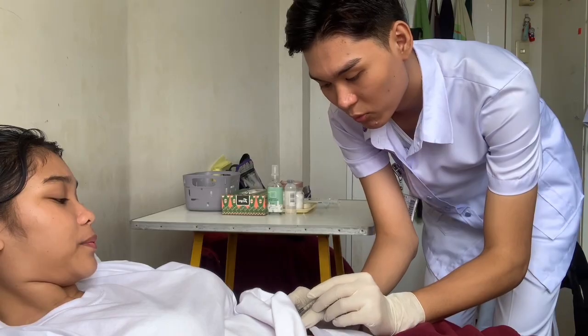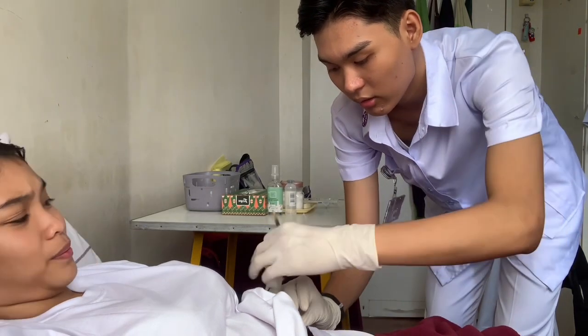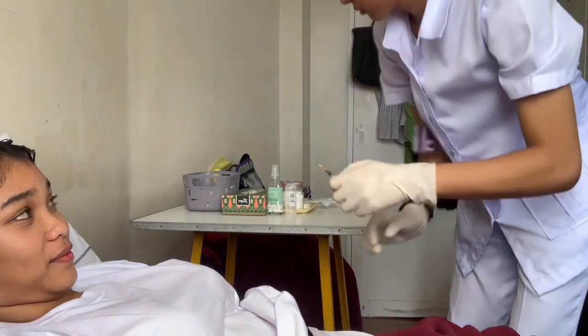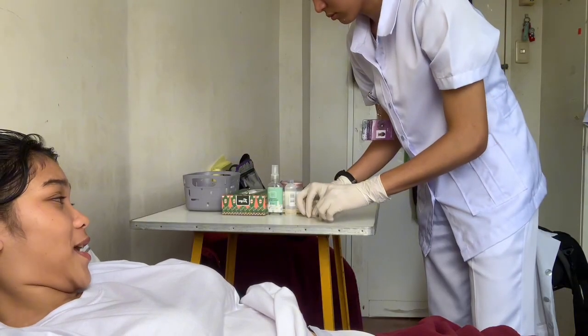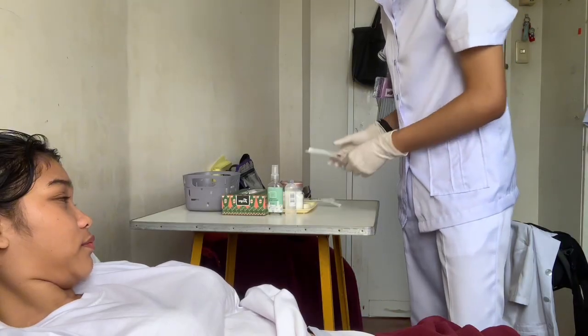Now, remove smoothly and put this up. Now dispose.